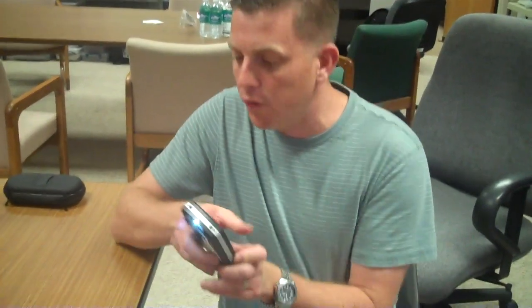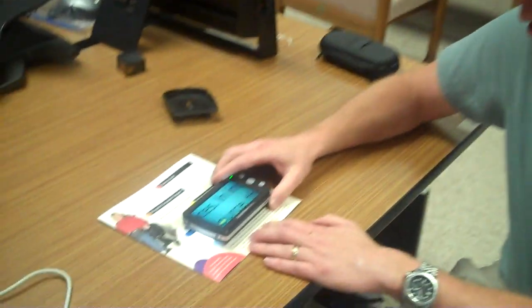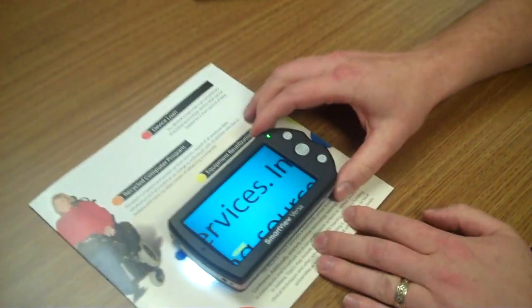It has levels of magnification that will go up to 15 times magnification on this 4.3 inch screen. So what we can do is we can turn it on — it has lights that come on — and it allows us to put it right up on top of the material and read that material.